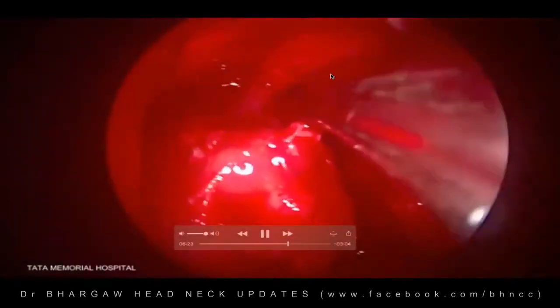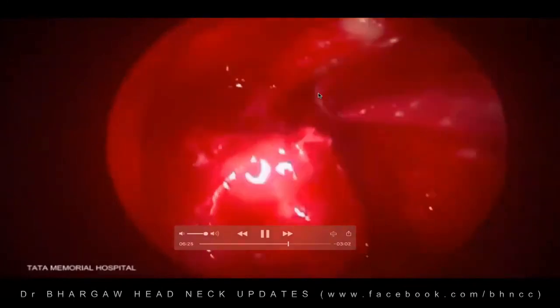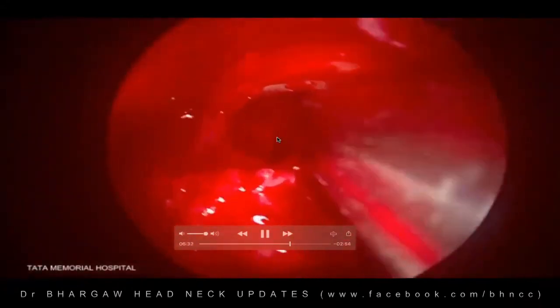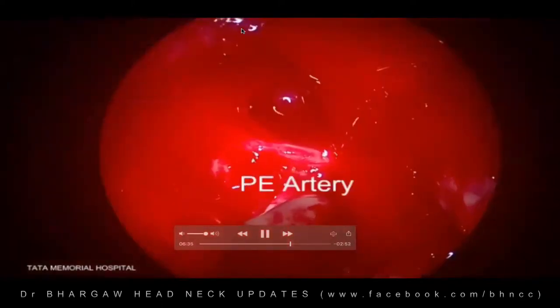Now the frontal recess on the opposite side is also being opened, and now we have done a Lothrop. This is the frontal beak area. We're just drilling it to see that. That is the posterior wall of the frontal sinus. This is the frontal beak anteriorly.